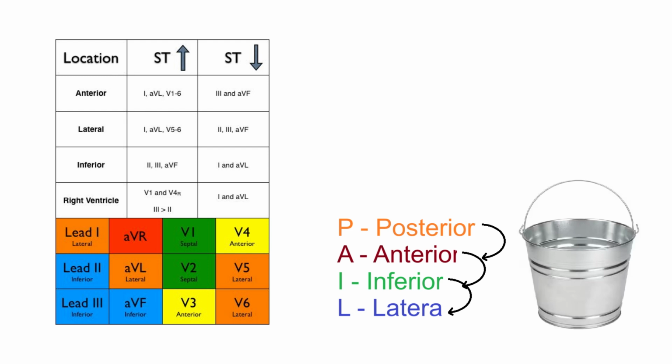Remember that the EKG changes generally follow an anatomical pattern, although the lines between these anatomical regions can sometimes be blurred. You don't always have EKG changes that fit neatly into a specific pattern. You might have EKG changes that look to represent an anterior lateral pattern or an anterior septal pattern. Also remember to look for reciprocal changes, knowing that a posterior MI is only going to give you anterior reciprocal changes.